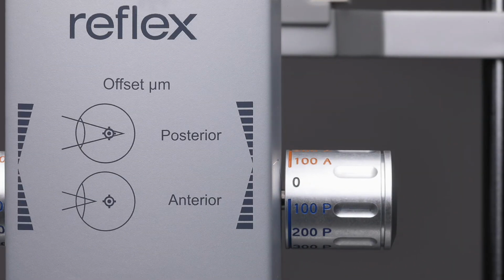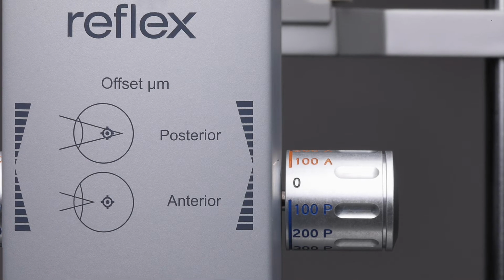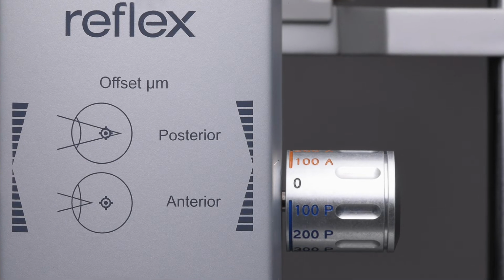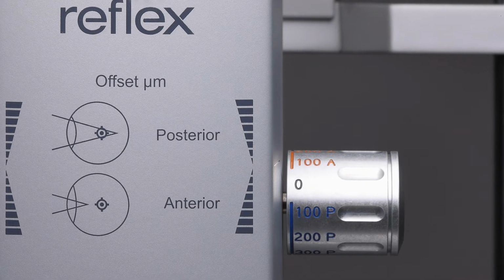Let me demonstrate this in action using dry ice. The fog produced makes the process quite visible, as you can clearly see here. Now, with an awareness of the high degree of temperature anticipated at the laser focus, it would make sense to maintain a sufficiently safe distance between the IOL and the plasma formation.